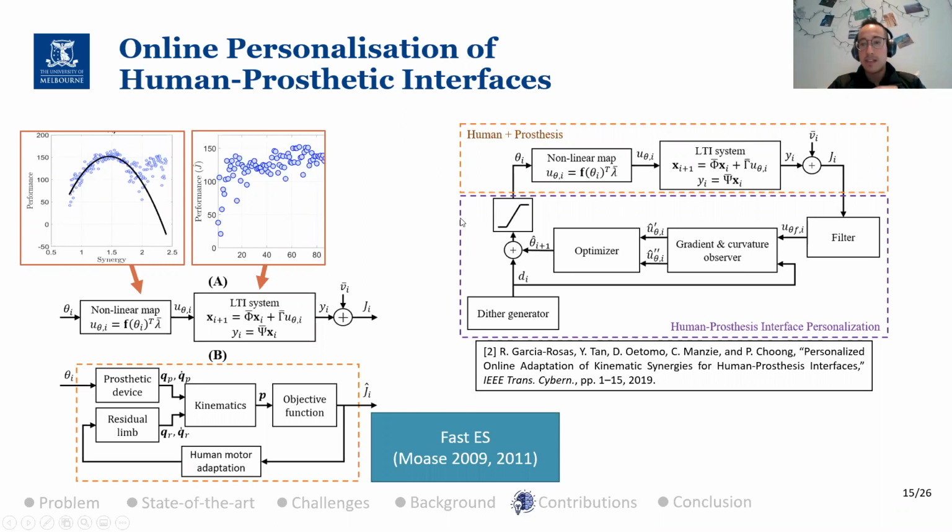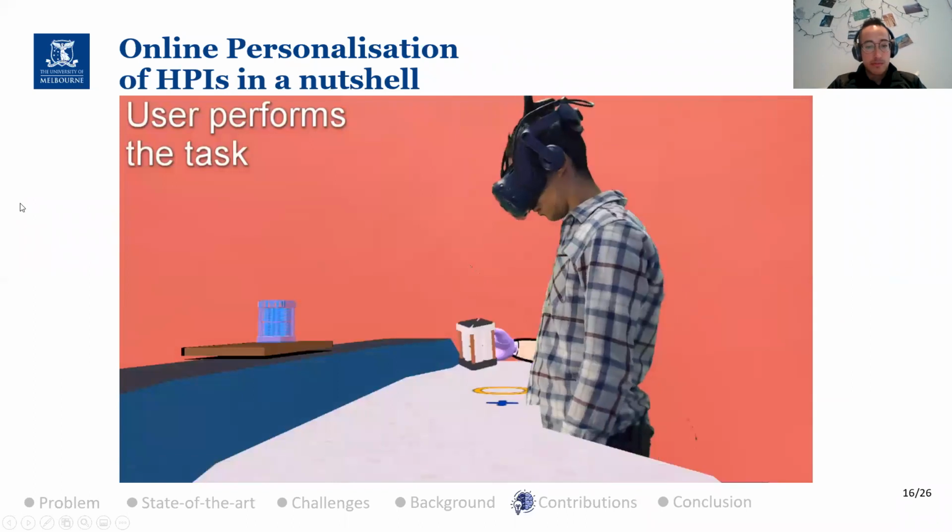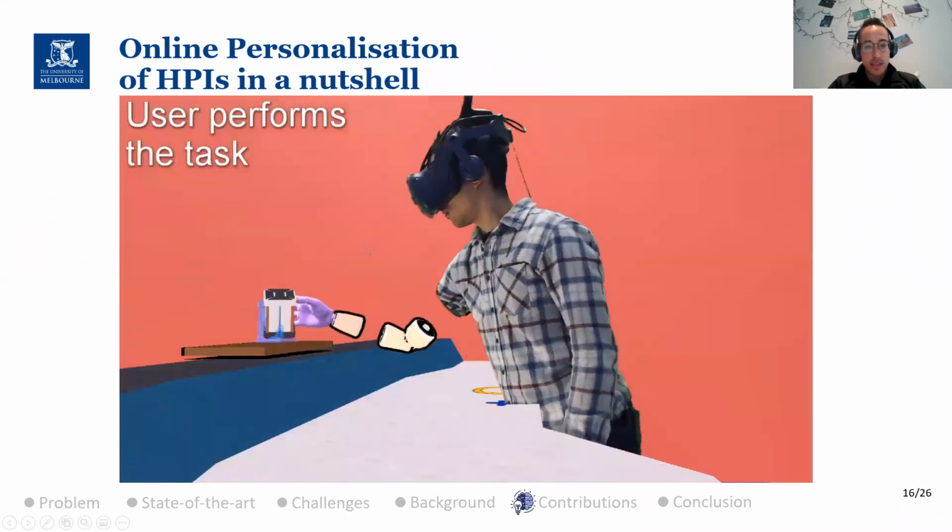And the whole idea is that this will significantly speed up the convergence of the algorithm, so that we won't need to wait for the person to reach steady state or tune it individually. I can talk a lot about how this sort of thing works, but it's probably a good point to show you a video of how this works.